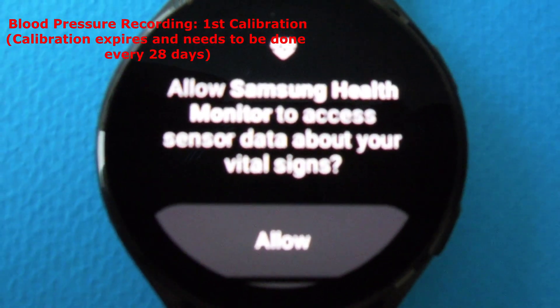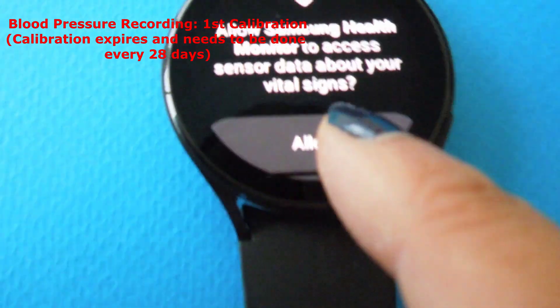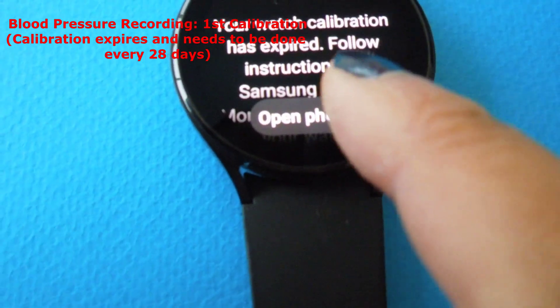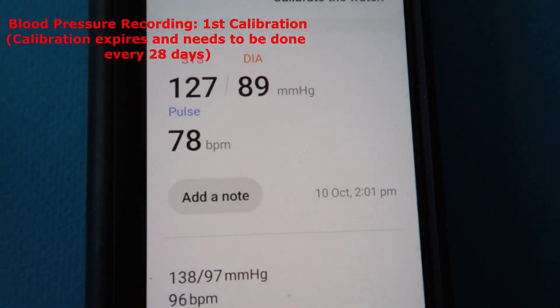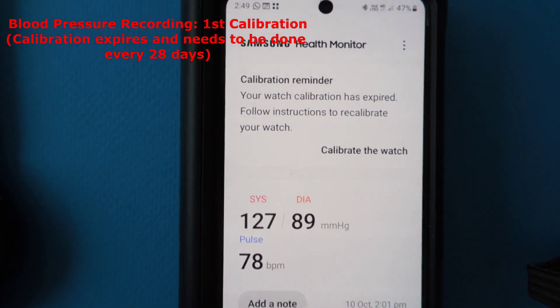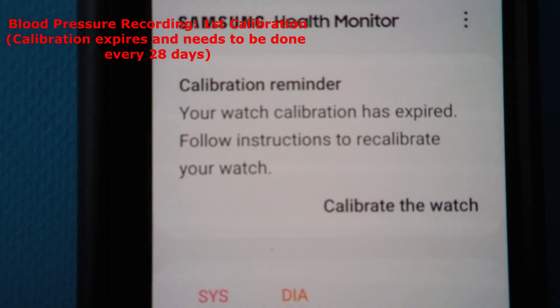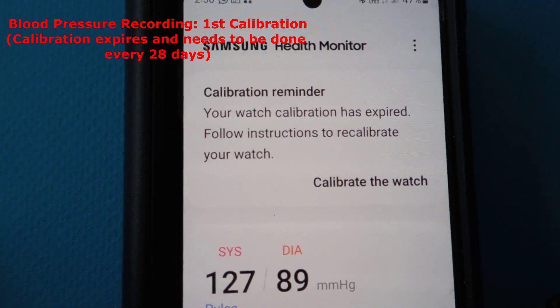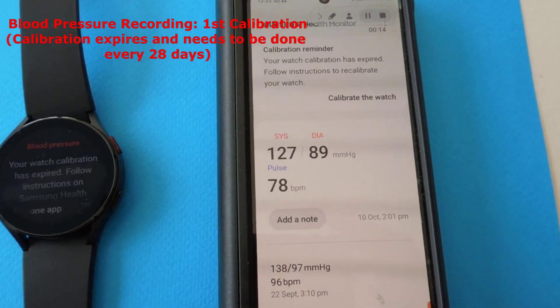The watch is asking me to allow Samsung Health Monitor to access my sensor data about vital signs — I click allow. It confirms the watch calibration has expired and instructs me to follow the recalibration steps. I open the instructions on my phone, which launches the Samsung Health Monitor app, showing that calibration has expired and I need to follow the instructions to recalibrate.